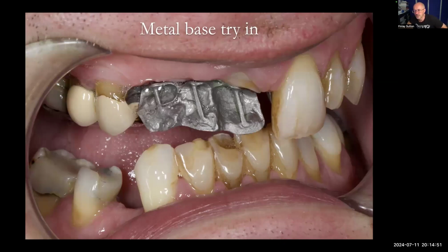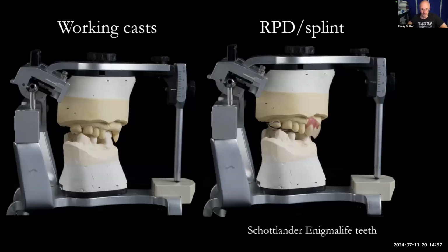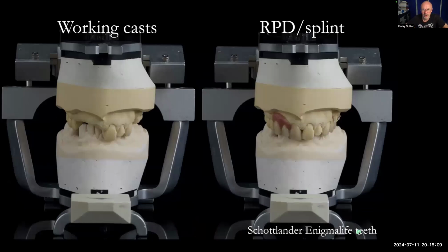Right. So once I'm happy with the metal base there, we then go straight to fit. So Rowan then adds the teeth on and he puts the teeth back on exactly in the same place as when we did the try-in. Because this is so important in prosthodontics. What I found really frustrating in the past is when I've done a try-in, a prototype, and then the finished product is different. The teeth are in a slightly different place. And this is the sign of a really great technician, if they can put the teeth back in just the same place as the prototype, as the try-in.